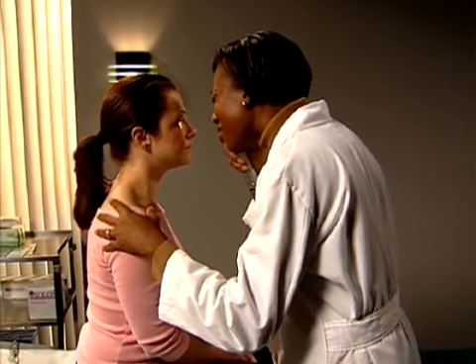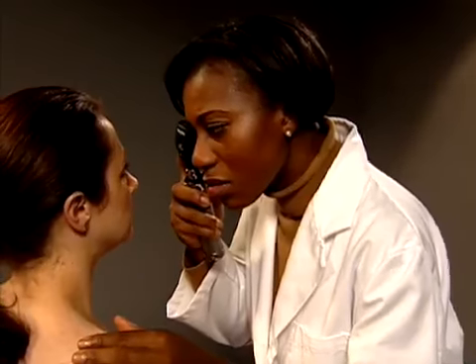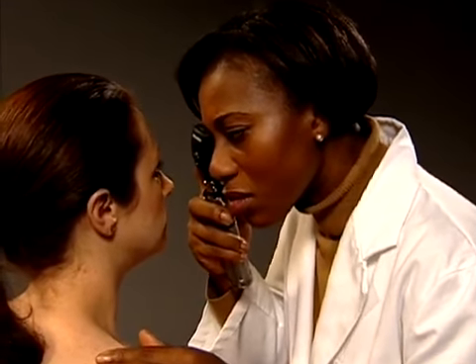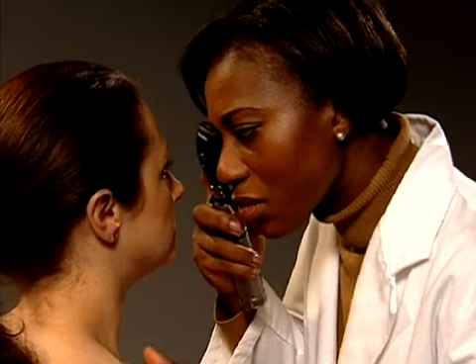When examining the patient's right eye, switch the ophthalmoscope to your right hand and eye. As you did with the left eye, check for a red reflex, and then inspect the fundal structures, noting any lesions or other unexpected findings.